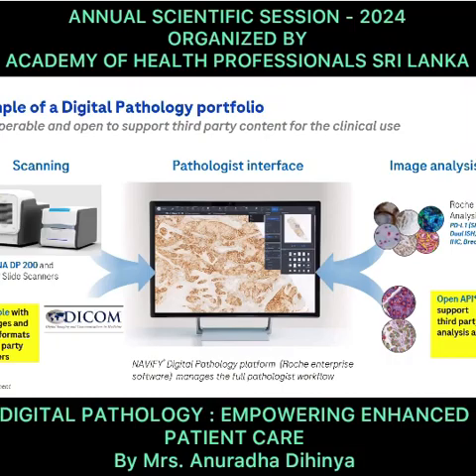Now, the universally accepted format for the digital slide is the DICOM format. So you need to see that whichever scanner you're buying has this DICOM format capability. Now, storage is always a concern for any institution.